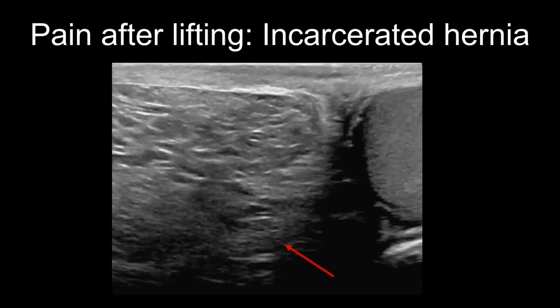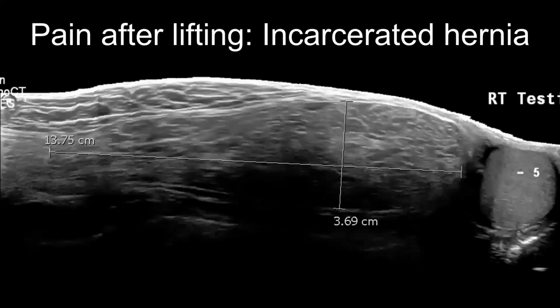He did not have bowel herniated with it, but that's the other thing that you would look for. And this is how big it was. There was actually a lipoma in his cord and also the hernia, but here's his testicle.